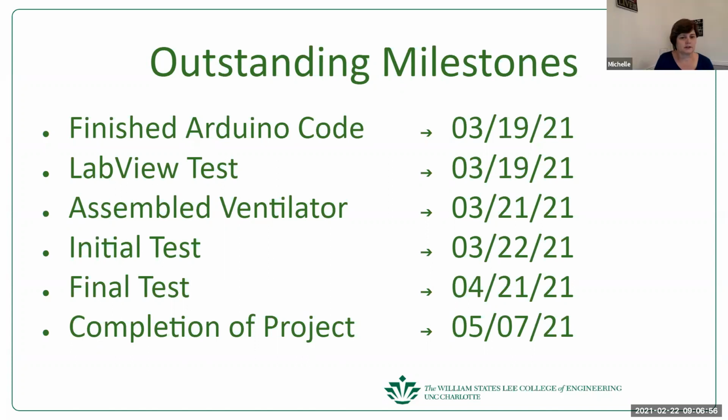Another question I'm trying to get at: are the first two bullets assuming that you're actually connecting hardware, communicating with one another, and operating valves, and then assembling the ventilator? So that's just like a benchtop test. Yeah, and assembling the ventilator is actually the tubing and the blowers and pressure tanks.